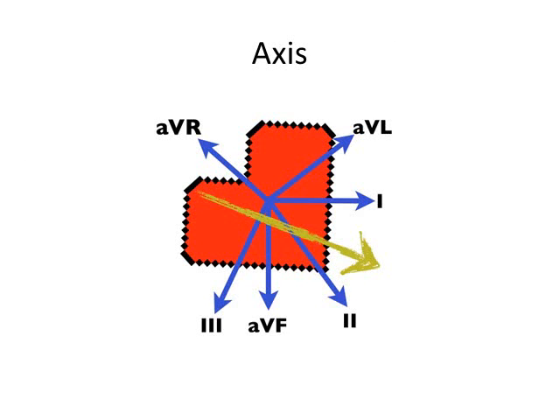So going through axis. Basically what the axis is showing is the direction of the impulse. It starts off here and comes down here. So if you imagine it starts off at around the 10 o'clock point and goes down to about the 4 o'clock point. And that's just the direction of the impulse within the heart, if you imagine it going down like that.